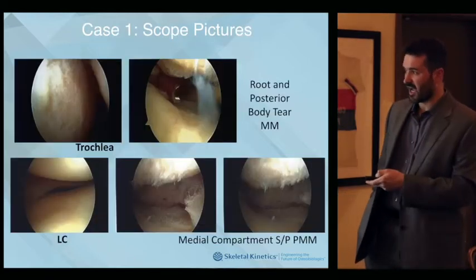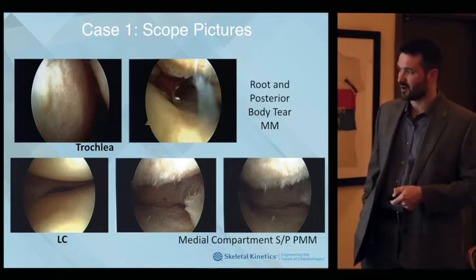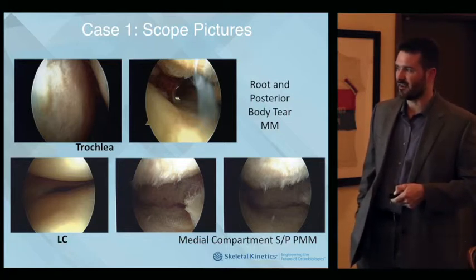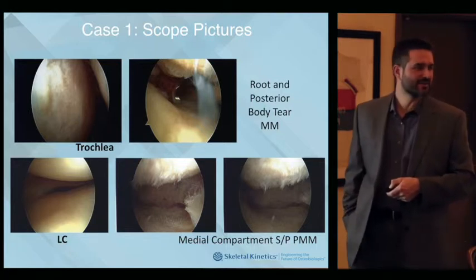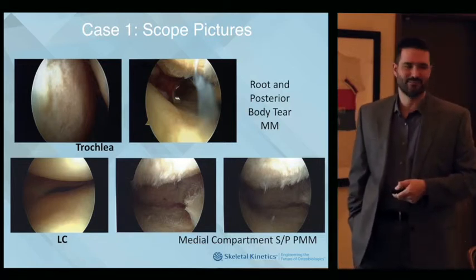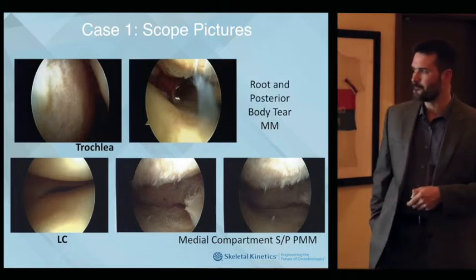So this is her knee, and she actually has a pretty bad knee. So she didn't have pain before, really, but that's bad cartilage. I mean, there's a normal side or lateral side, there's her medial side. I mean, this is bad. I mean, just cleaning this out probably isn't going to help her at all. I have patients like that, you go in there, it looks like this, that's bad, there's nothing you can really do for that. I don't know if you ever help those patients or not.